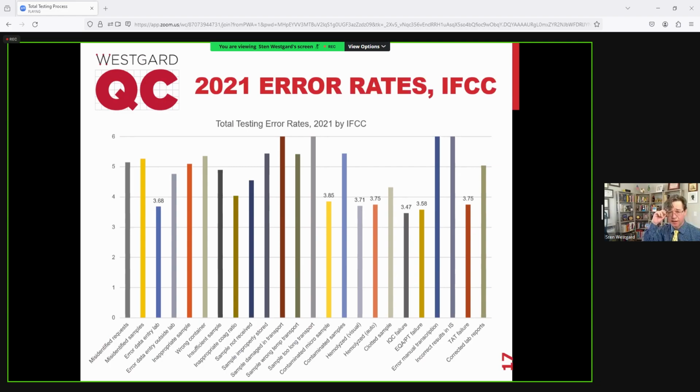I should note this particular set of sigma metrics is the 50th percentile of their surveying group. So they look at a bunch of laboratories, they collect in this program measuring these processes, and then they'll break out, well, here's the 10th percentile, and there's the 90th percentile. This is the 50th. So this is what, let's say, the average laboratory, their biggest problem is QC. Their next biggest problem is passing proficiency testing.